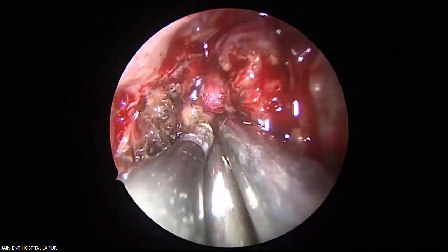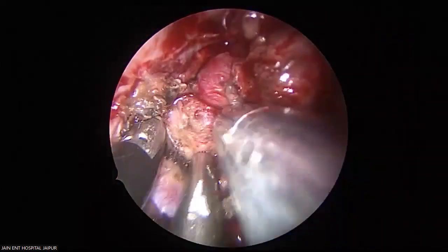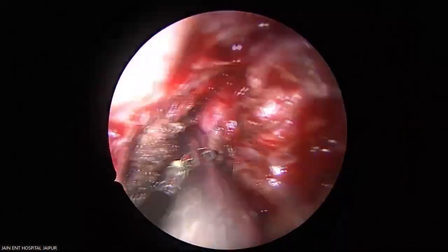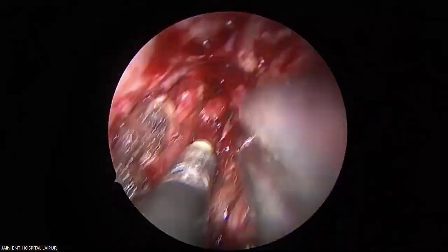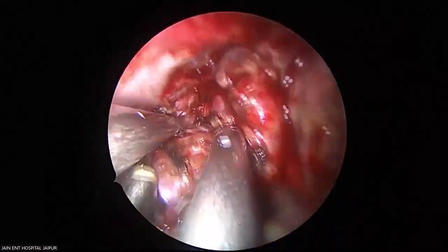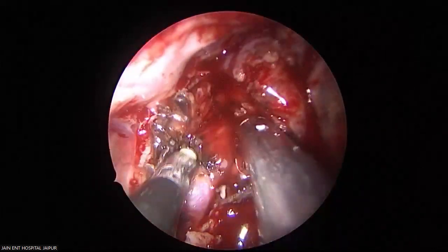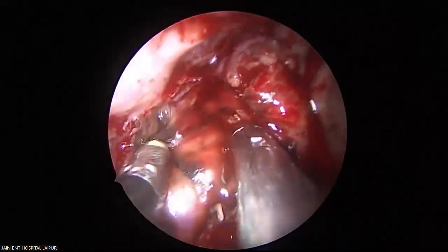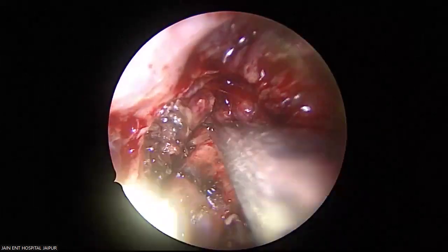One of the branches I have cut. A lot of vessels in the convolutions of the tumor. See the area. We are right in the infratemporal fossa with this kind of exposure.